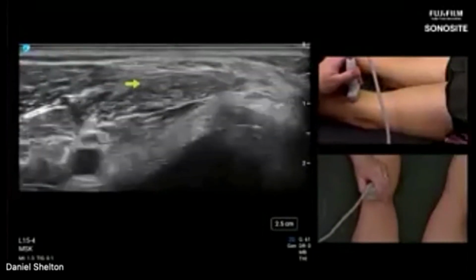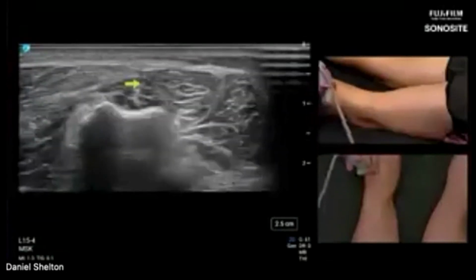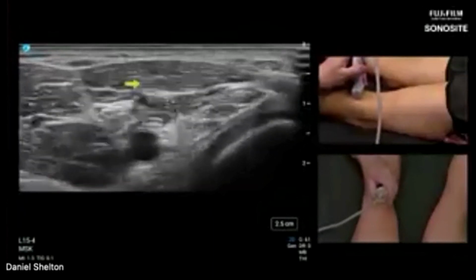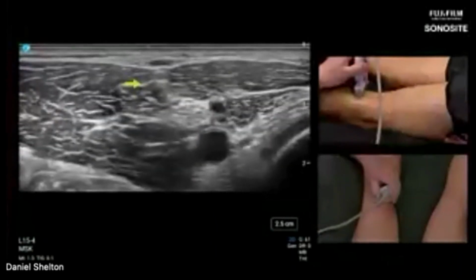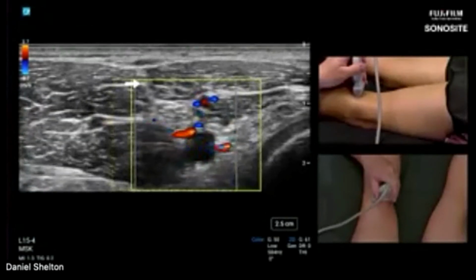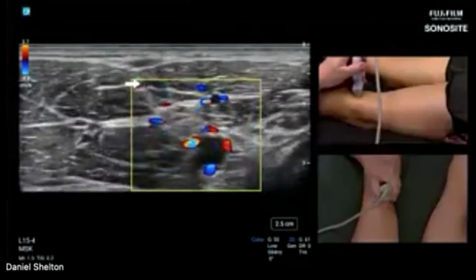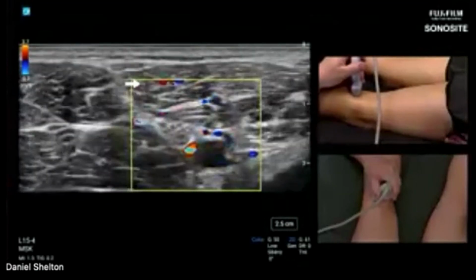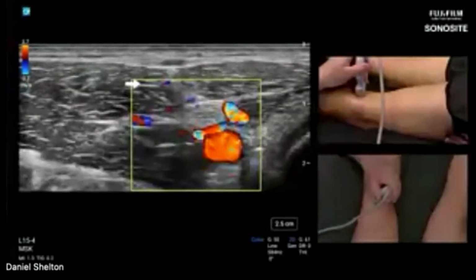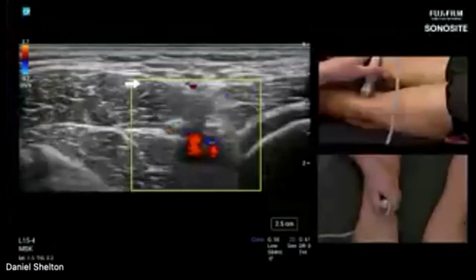There's only so much stuff to look at on the back of the knee on a basic level. You can sit here all day and just talk about nerves. The PCL is pretty cool. Neurovascular structures are just fascinating. Throw the color on, you'd be surprised just how much crazy anatomy is right there under your transducer. Any blind procedures would potentially be causing a little hematoma, or a hematomato, as one of my friends likes to call them.